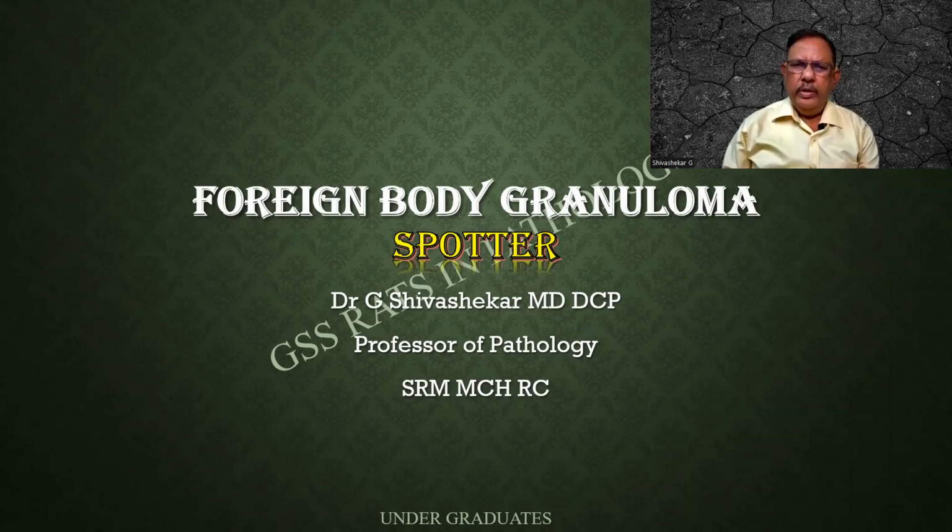The class for this session is short, at the same time, a little difficult for the students to explain. It is a foreign body granuloma. What is a granuloma? A granuloma is nothing but a localized aggregation of macrophages. And macrophages are nothing but the counterparts of histiocytes, the counterparts of monocytes in the blood.